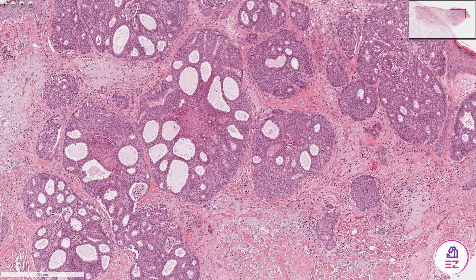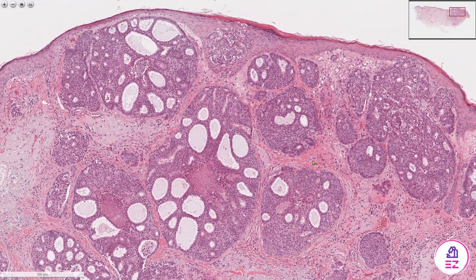This salivary duct carcinoma is typically positive for cytokeratin 7 and androgen receptor. They don't tend to show expression of basal and myoepithelial markers like p63, S100, and SMA — it's predominantly just an epithelial neoplasm.